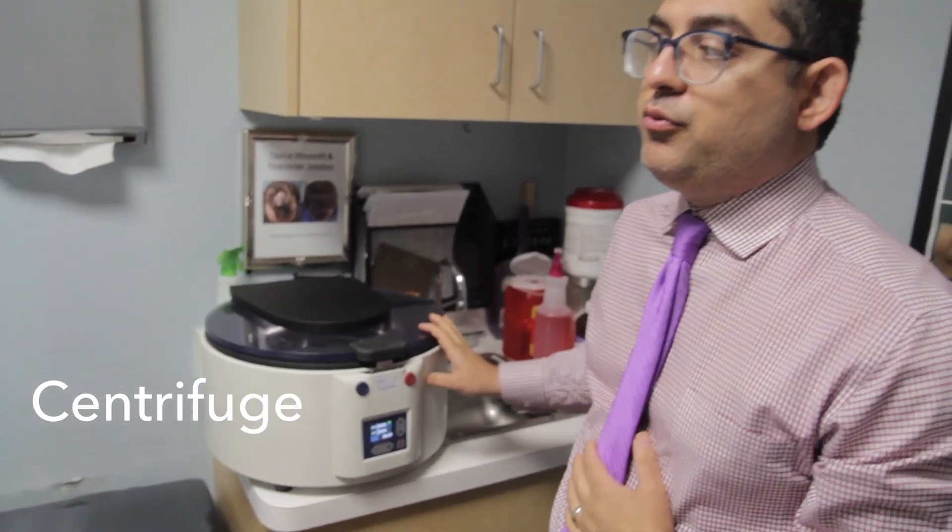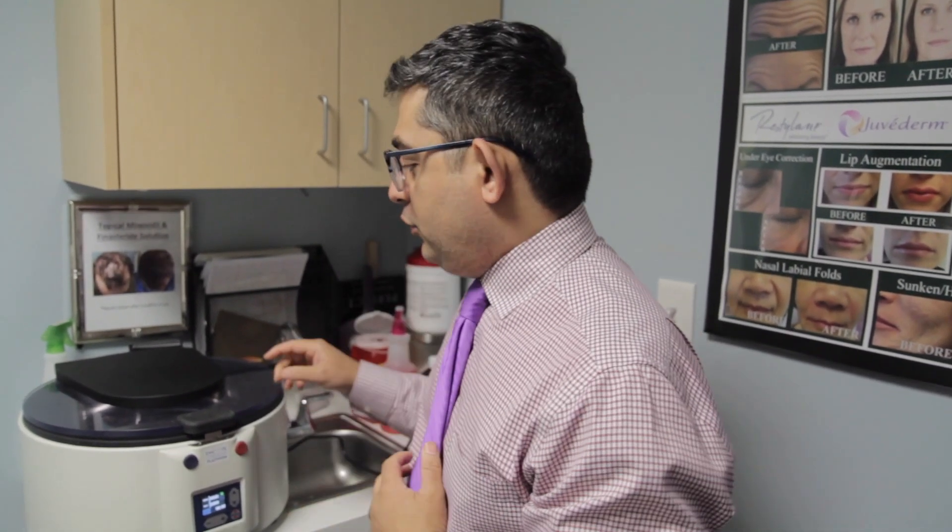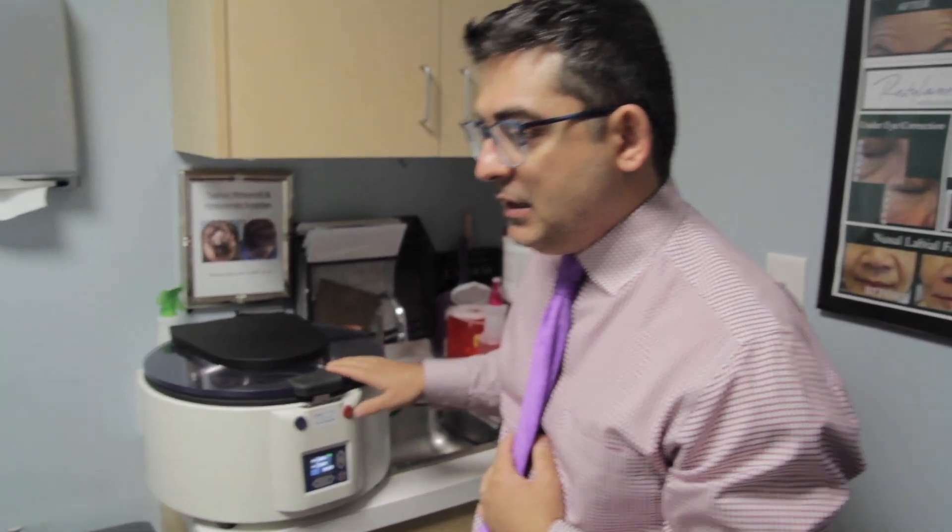PRP has gone through quite a lot of changes in the past 10 years. When we started doing it back in 2010, our centrifuge was really small and we would only basically spin the blood once. But the way we do it now, in order to get much better results, we actually take more of the patient's blood out. This allows us to concentrate more of the growth factors. We also spin it twice in our centrifuge — a first spin and then a second spin for six minutes to get what's called the buffy coat, which allows us to concentrate growth factors from the patient's blood much better. This is why we actually see much better results.